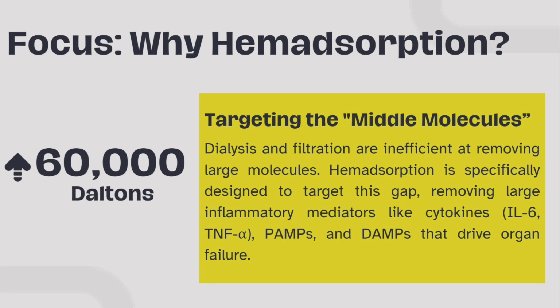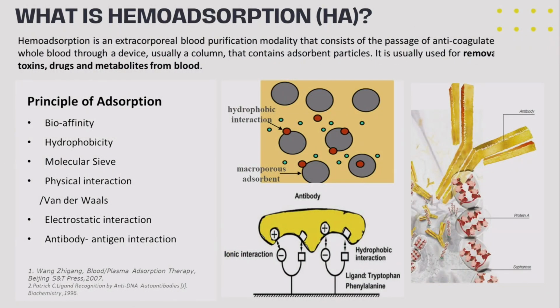We can do that with plasma exchange. But we need to infuse plasma. So it comes with a cost. So now we are looking at a therapy which will take care of the protein bound toxins, but we are not required to give anything to the patient. So it's a selective removal of the protein bound toxins.